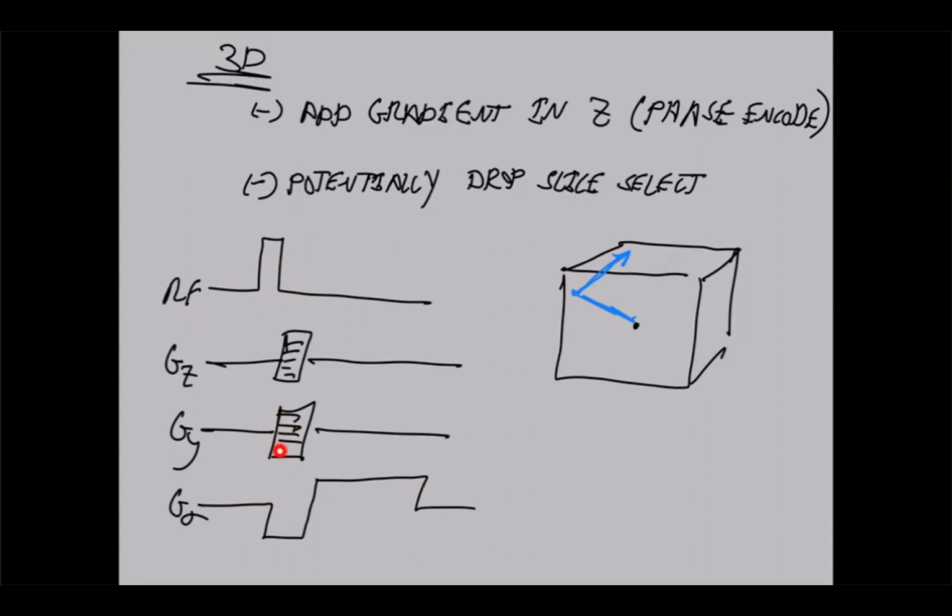This is the phase encoding in Y. This is the readout in X. And now we're going to add another phase encoding in Z, in the slice encode. So effectively, now we're going to traverse K-space in 3D, and we're going to start in the middle of K-space, then go to the edge, and then collect one readout. And then we're going to go again from the center all the way here and collect the second readout, and then over here and collect the third readout till we finish the entire line.